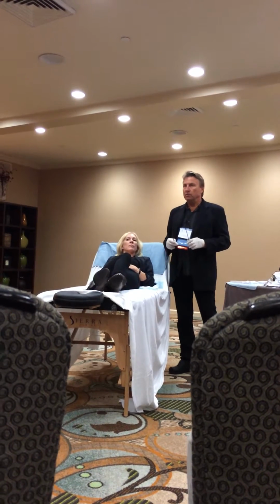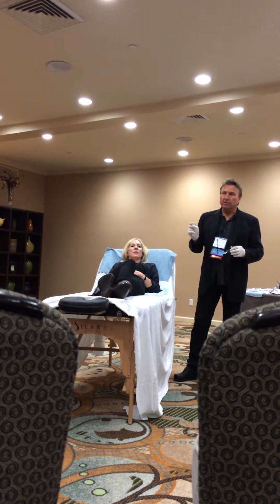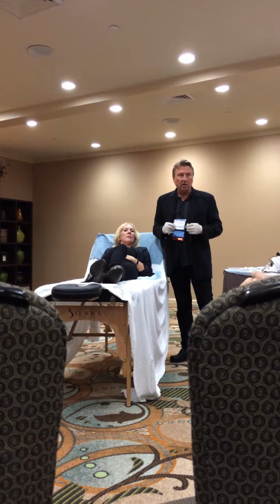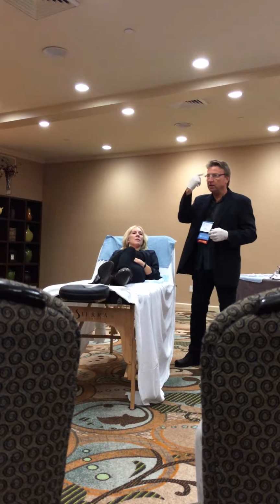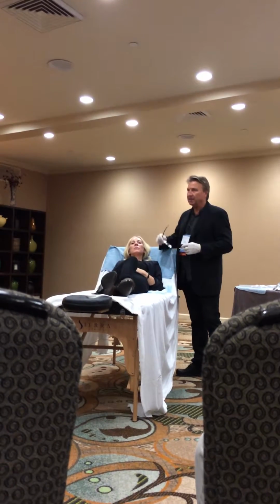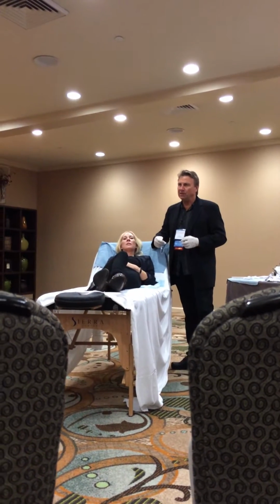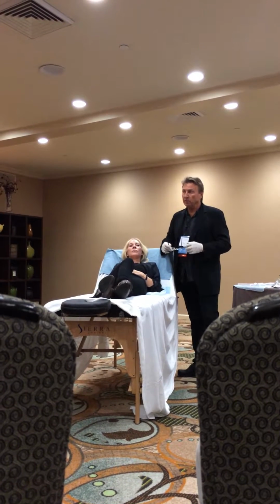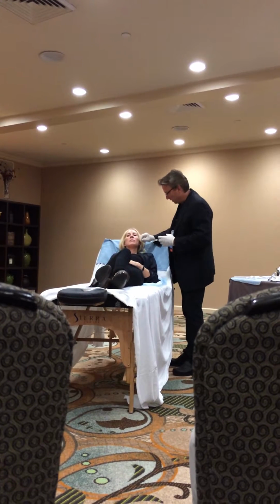And Peter has some really neat needles, and he's going to be coming up in about 25 minutes. He has the little needles that are not sharp and have a port on the side. It's a 27 gauge, 1 inch, where it's less likely that can happen, but it's something we think about, particularly around the eyes. Okay, it's pretty rare. I remember when there were only like 6 cases of it 10 or 15 years ago in lectures, and it was from fat transfer at that time, but now it's happening more often because so many people are using HAs. They don't push hard. That's one of the ways to minimize.